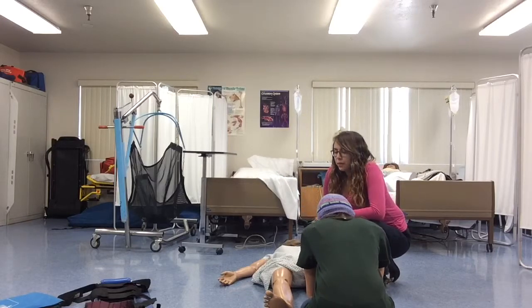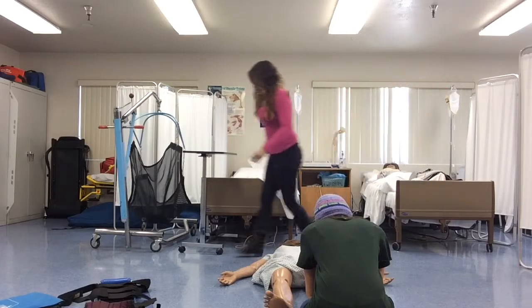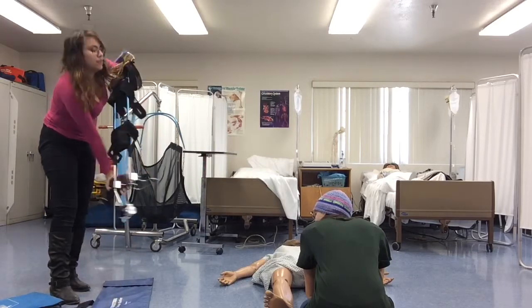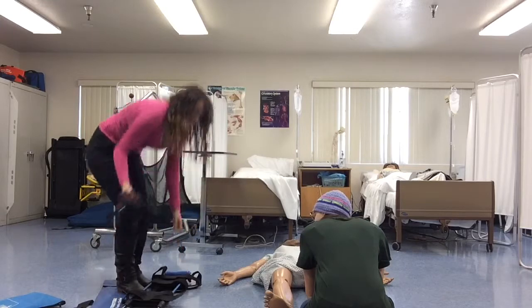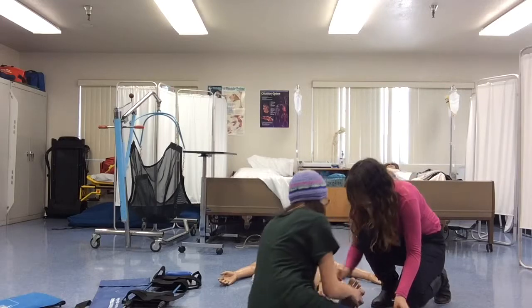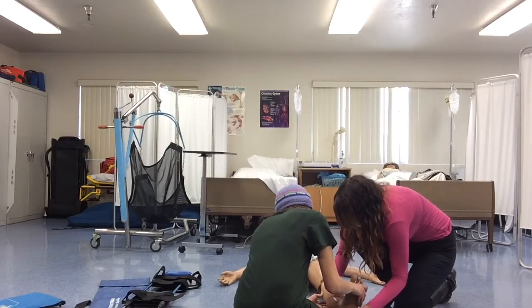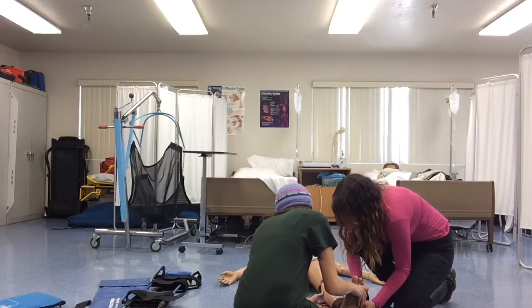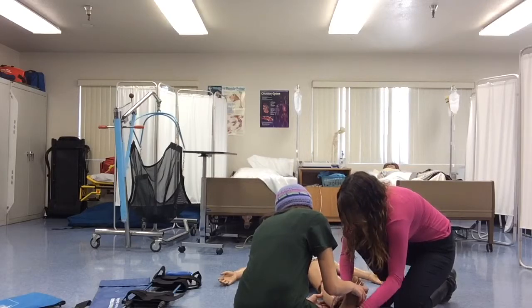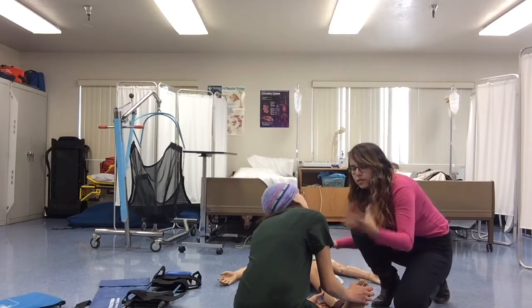I'm going to be applying the bipolar traction splint. So, let me get this. Okay, so here's the splint. The first thing I'm going to do is apply the ankle harness. Okay, make sure it's a snug fit. Now that the ankle harness is on, I'm going to have my assistant pull for traction.